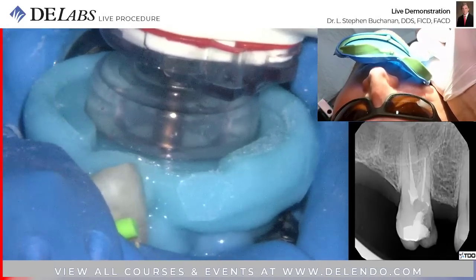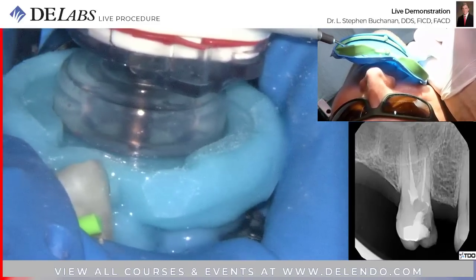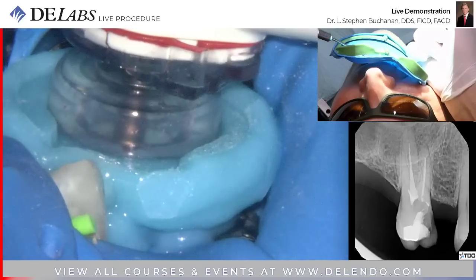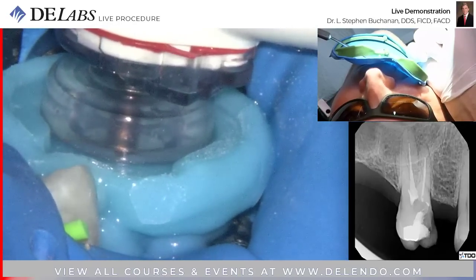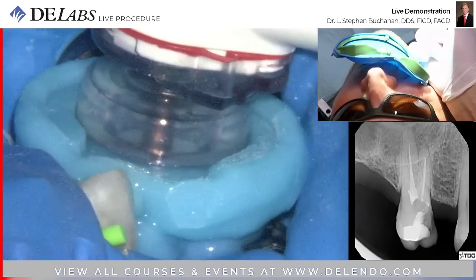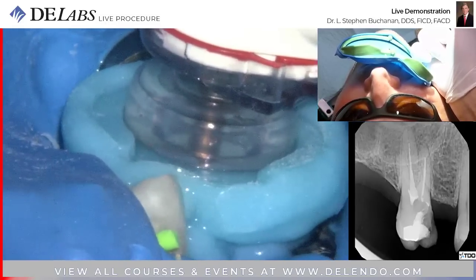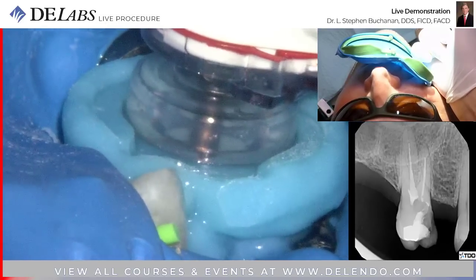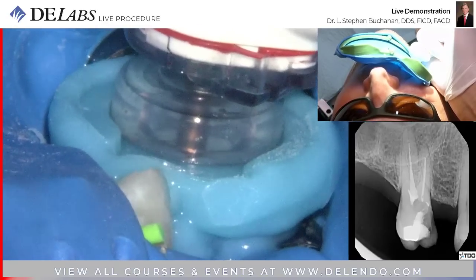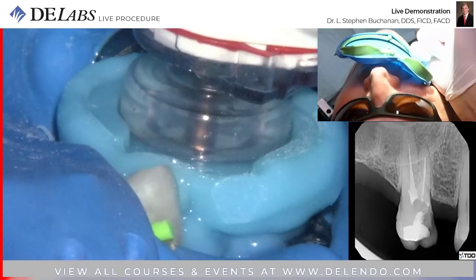It just lifts off. I'm going to put the edge of a locking plier into there, and it'll just peel off. Is that like rubbery? Yes, it's like rubbery. Yep. This is Cool Dam, OEM'd as Sound Seal. It's actually an awesome rubber dam seal. It's the best rubber dam seal I've seen because it doesn't get goopy. Once it's set, it's nice. 3 minutes and 20 seconds.